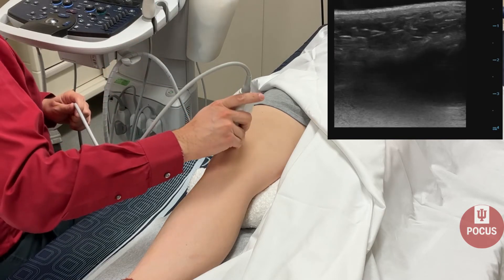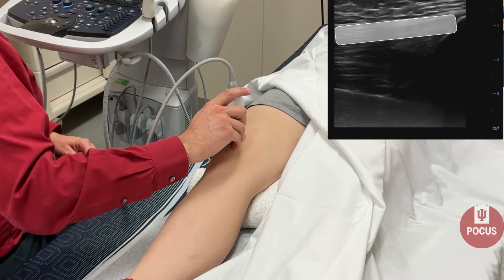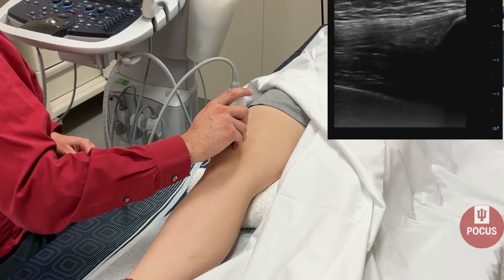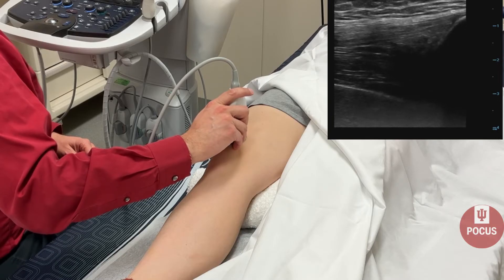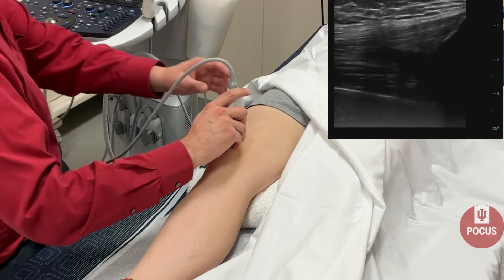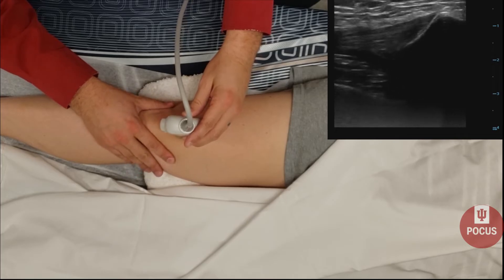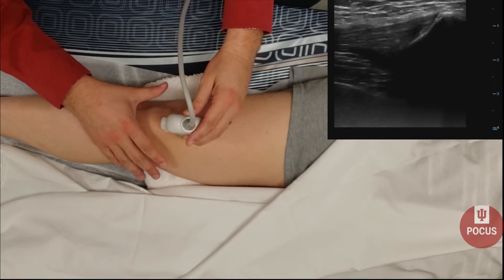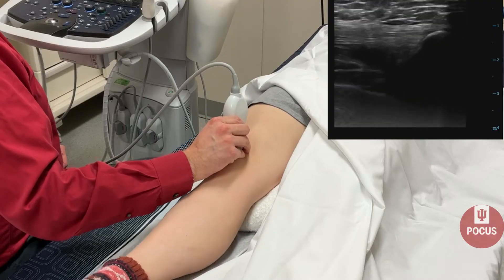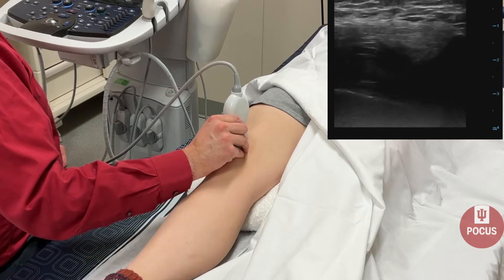First, we'll look at the superior anterior knee. You can see the quadriceps tendon, the femur and the patella, and the two fat pads that a suprapatellar effusion might come through. If you're having trouble identifying a suprapatellar effusion, one thing you can do is squeeze the knee, and that'll push some of the fluid up into the suprapatellar pouch, or you can have your patient extend their knee, and that will also bring some of the fluid into the knee joint.